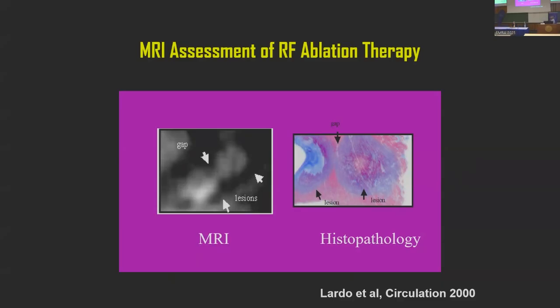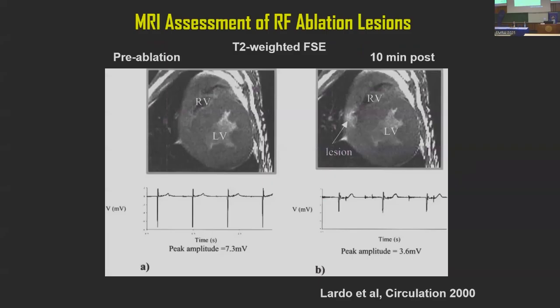So just to give you a bit of the quick history, when Al Lardo did this early work, first of all, he looked at T2 weighted imaging and did an ablation in this area.